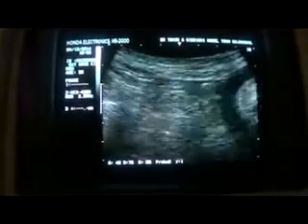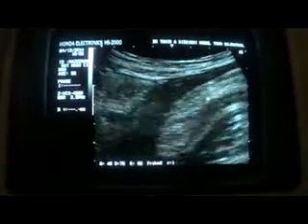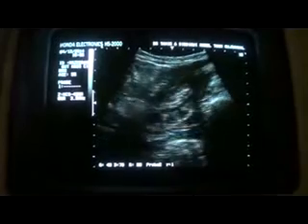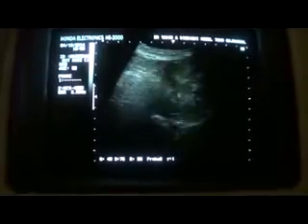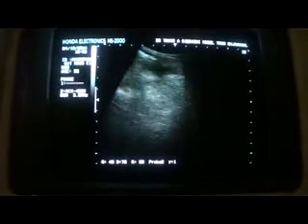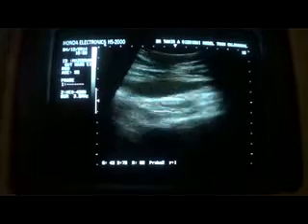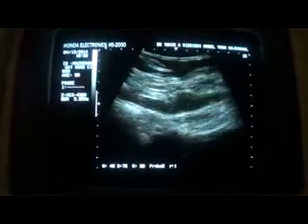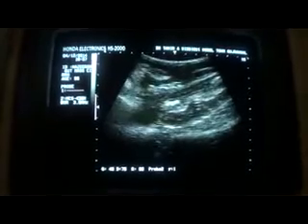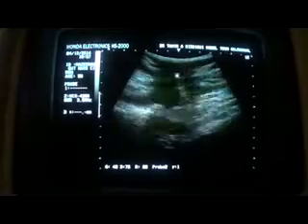and this is the lowermost end of this bowel pathology. So this is our case of the day, in which we see the patient is having chronic liver disease, cirrhotic liver disease, as well as bowel-related pathology, and they have thick mesentery, and small amount of ascites is seen in the dependent region of the peritoneal cavity.